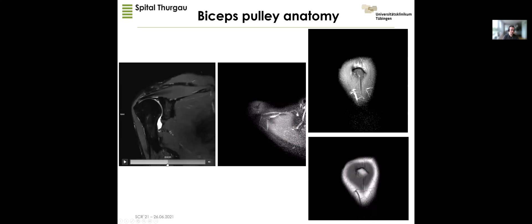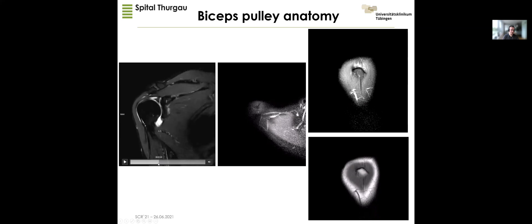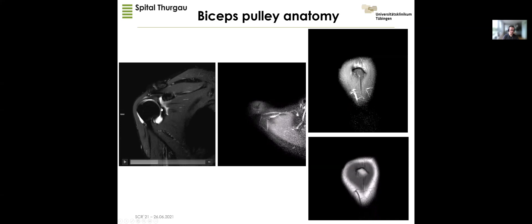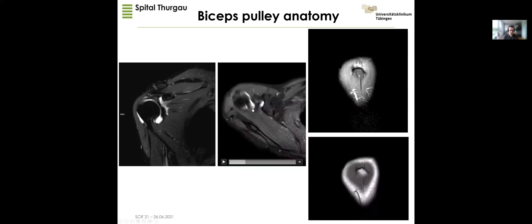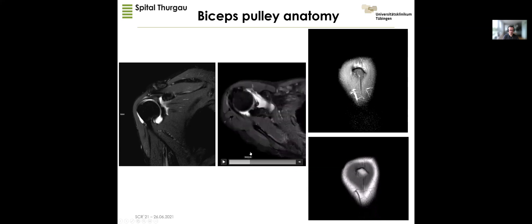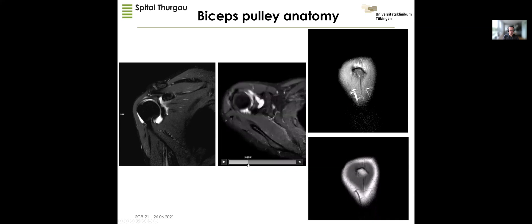Going back to the ventral part, we see the attachment of the long head of the biceps tendon which looks normal. Going more ventrally, we see a small structure coming from the coracoid process — this is the coracohumeral ligament. The mix-up of the SGHL and the MGHL — the middle glenohumeral ligament — makes it difficult to differentiate on the coronal view. On the axial view, we have the attachment of the long head of the biceps tendon, and going further we see more than one structure going to the lateral part; the coracohumeral ligament is only a very thin capsular thickening.